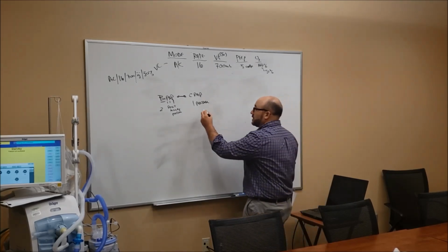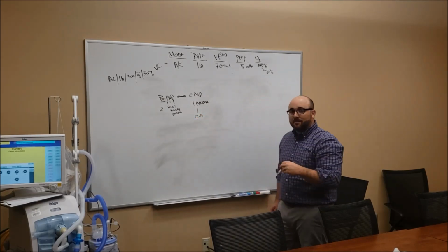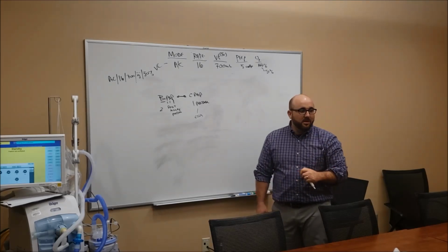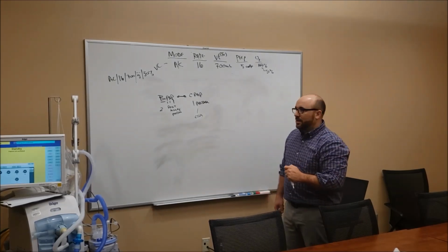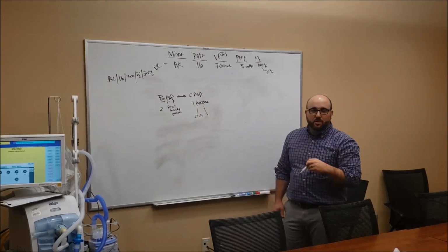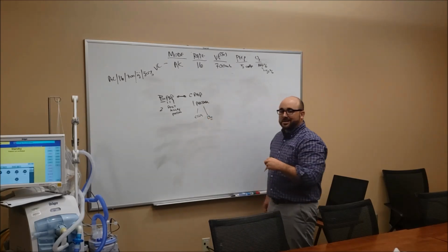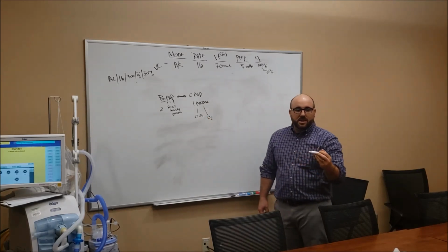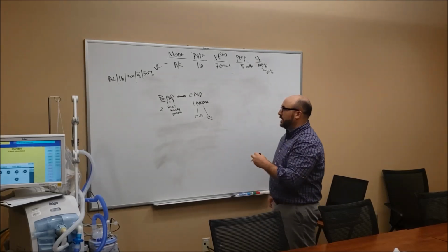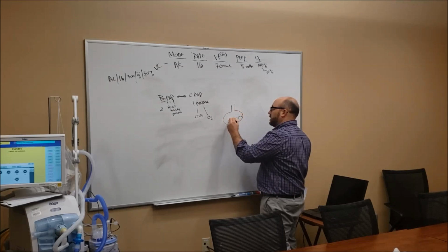Sleep apnea is the biggest one, especially OSA, which is obstructive sleep apnea. They have central sleep apnea, that's a different problem. It means their brain stem's not telling them to breathe. A lot of people do have that. Another one you'll see CPAP used for is somebody with a straight oxygenation issue or a CHF type issue. With CHF, they have fluid coming into their alveoli, and we need to push that fluid down. Now this is very generic.